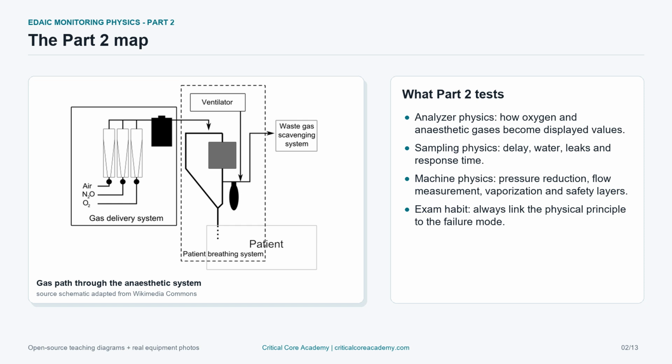Third, the anesthetic machine. We will divide it into high-pressure, intermediate-pressure, and low-pressure systems. That simple map helps you place regulators, flow meters, fail-safe devices, hypoxic guards, and the common gas outlet.